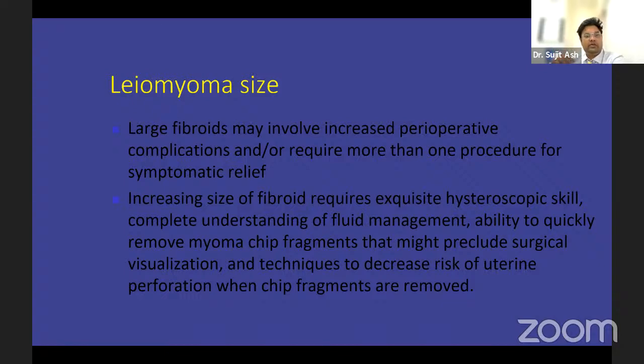Two, if I have to remove the entire fibroid chip by chip, it will require a lot of time, which means that the patient will take in a lot of fluid inside. Therefore, my again major worry is fluid imbalance, which can happen. So that is why always do it in 2 or 3 settings, which will be effective for the patient, rather than doing it at one go, which will be incomplete, or you might damage the health of the patient.